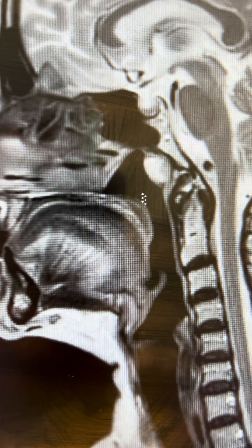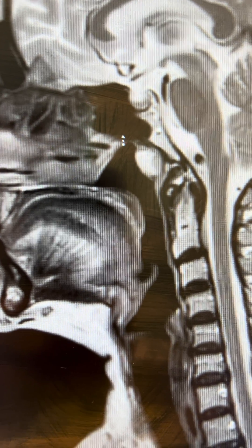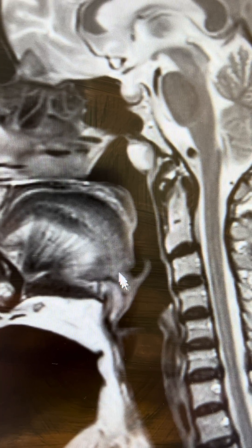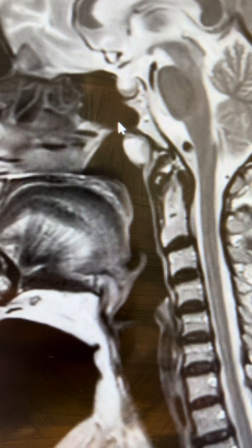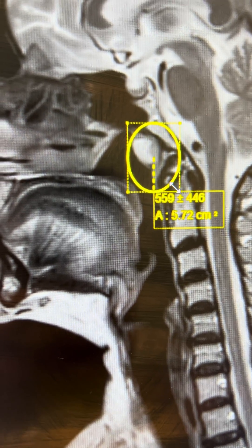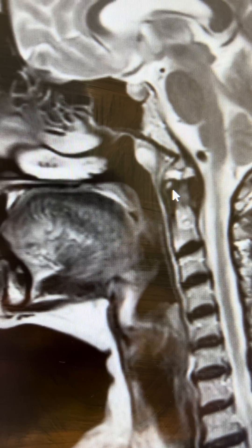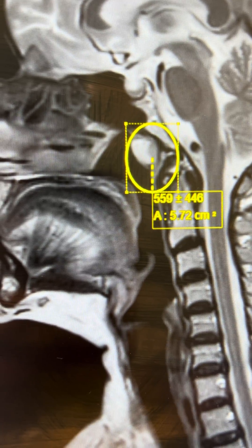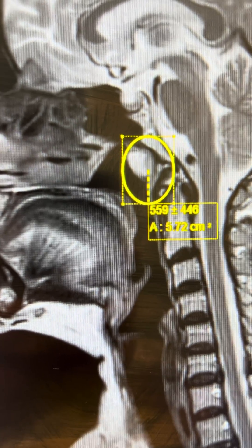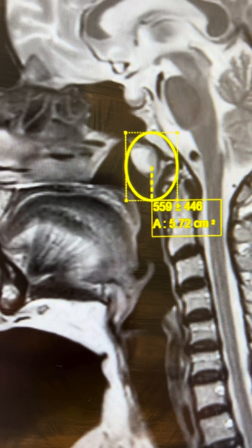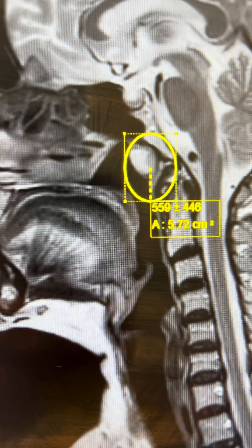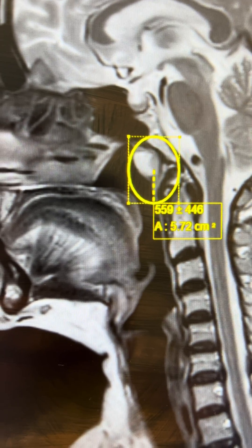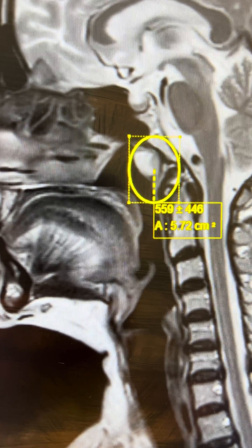So, what you can see over here — let me mark it out for you. This lesion is quite classical of a nasopharyngeal cyst, which is a Thornwald cyst.